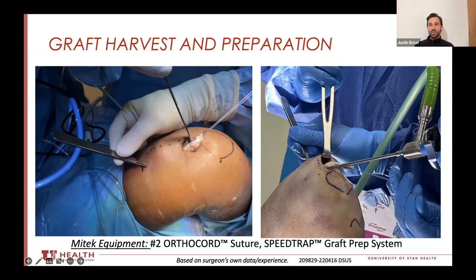If I have a more junior-level trainee and we're just trying to learn the basics of ACL surgery, then I completely drill out the tibia — it's just one less fussy step that could potentially go sideways when they should be learning the basics.